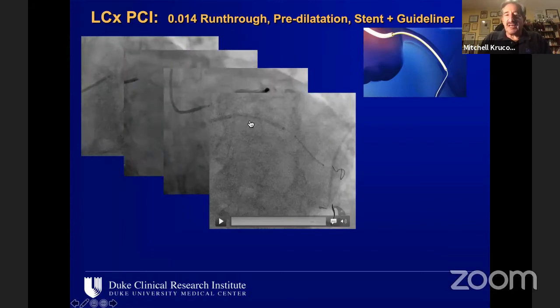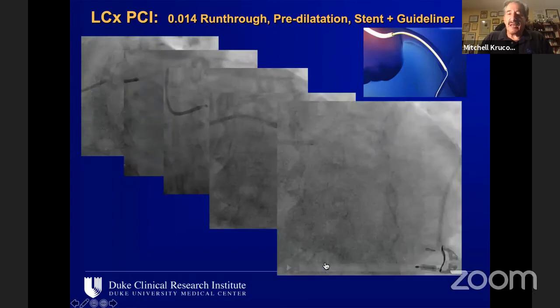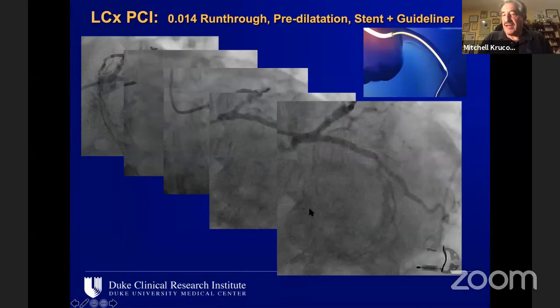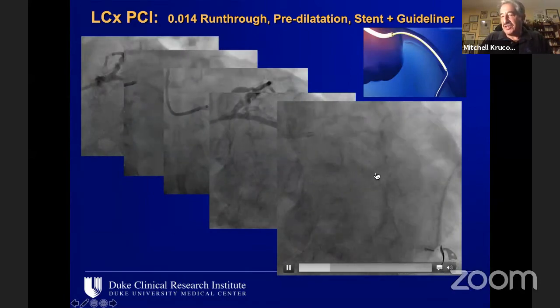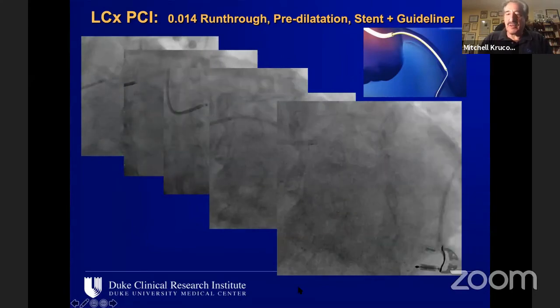So this is a guide liner that we walked over a balloon down through the proximal stent in order to finally be able to pass stent distally. And all in all, came forward with a reasonable result without having to convert it to a bifurcation lesion. There's obviously a tight lesion in the AV groove here, but the flow to the right coronary collaterals were unchanged.